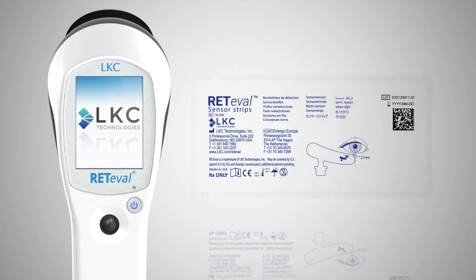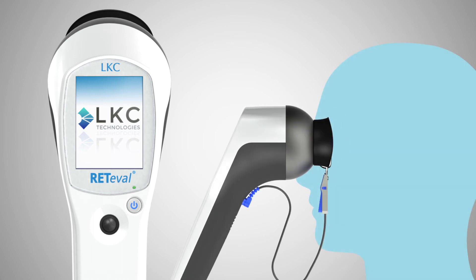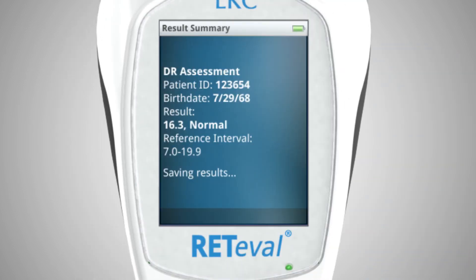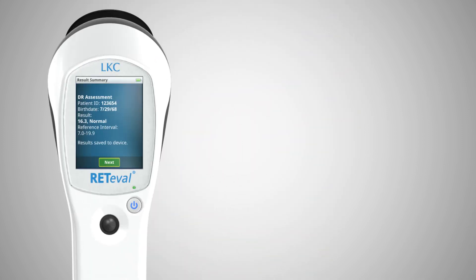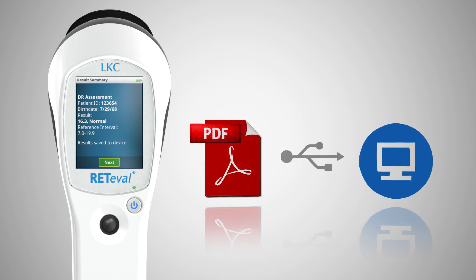Features of Redaval include unique patented sensor strips that streamline the setup process, auto adjustment of flash intensity based on pupil size, eliminating the need to dilate the eye, multilingual support, the ability to store results on the device for later review, and the ability to transfer results in PDF format to any computer via a standard USB connection.